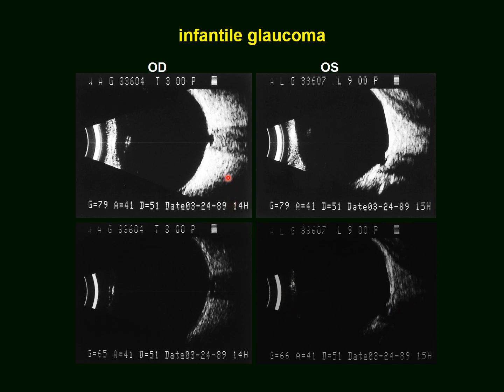Certainly the top ones are more appreciable and more beautiful, but they contain the blooming effect that narrows the excavations and make them appear shallower than they are.